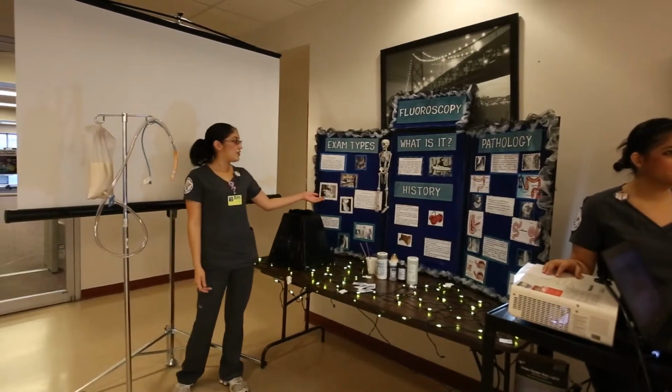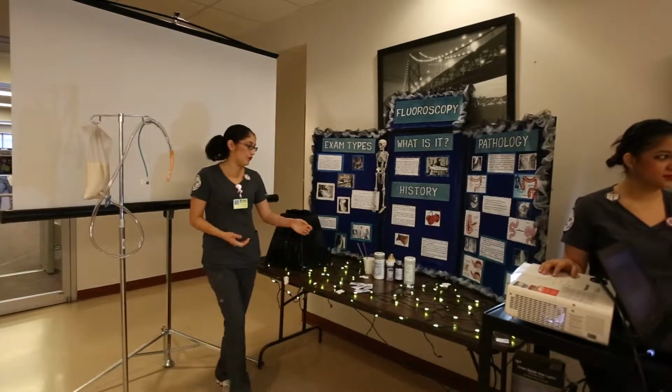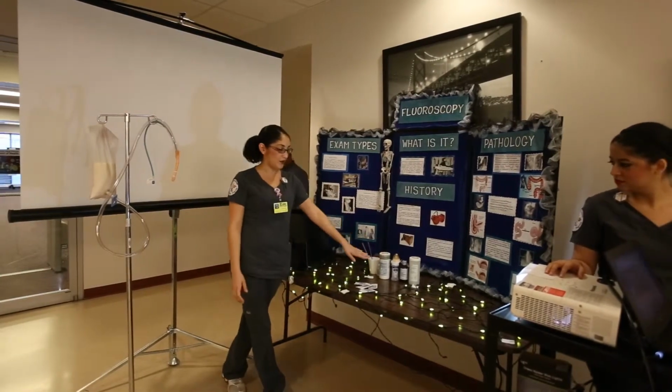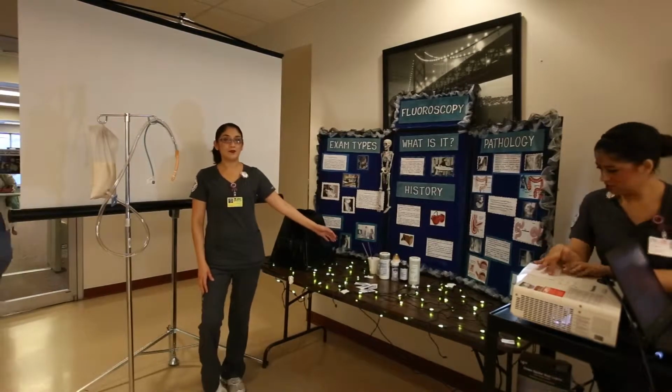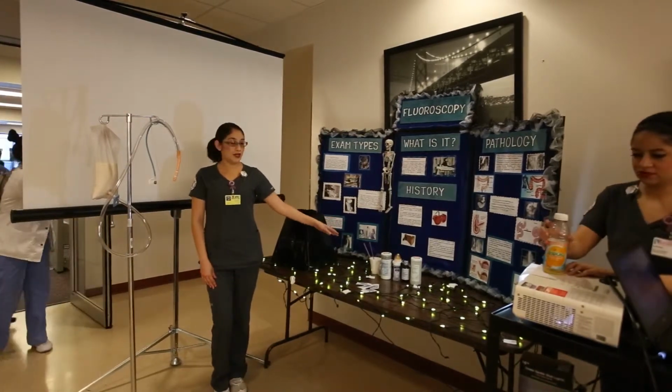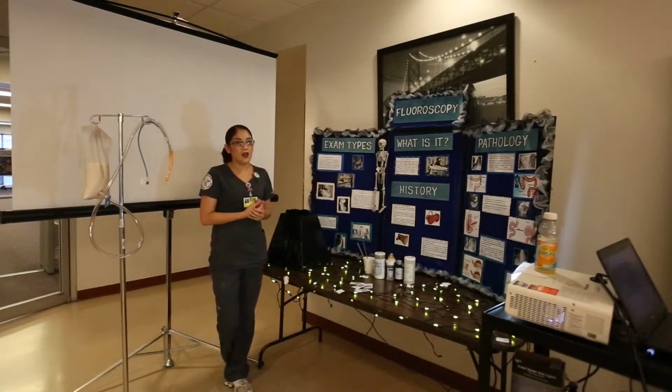And moving on to the small bowel series, that one is administered orally, and we will do the same thing with the barium or any other contrast, and we'd have the patient drink it, and it would then highlight the small intestines.